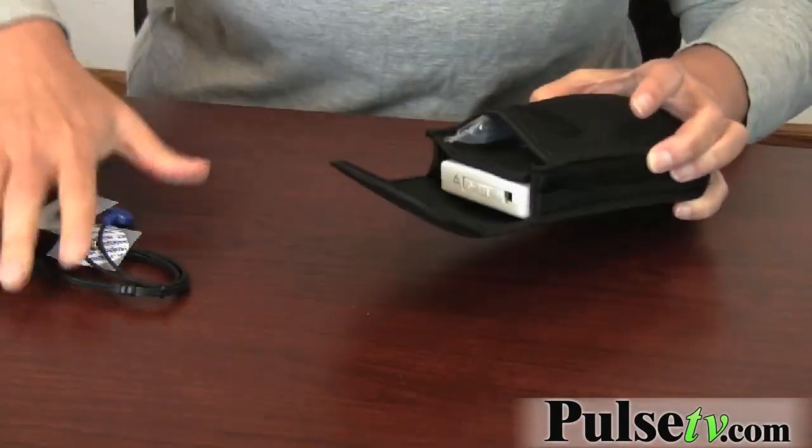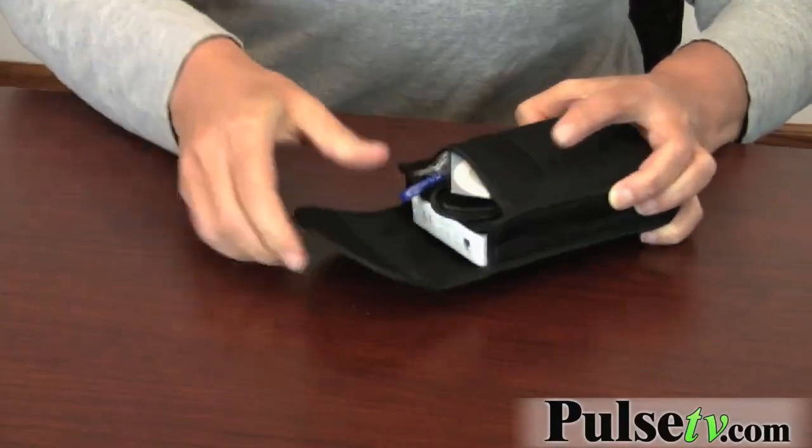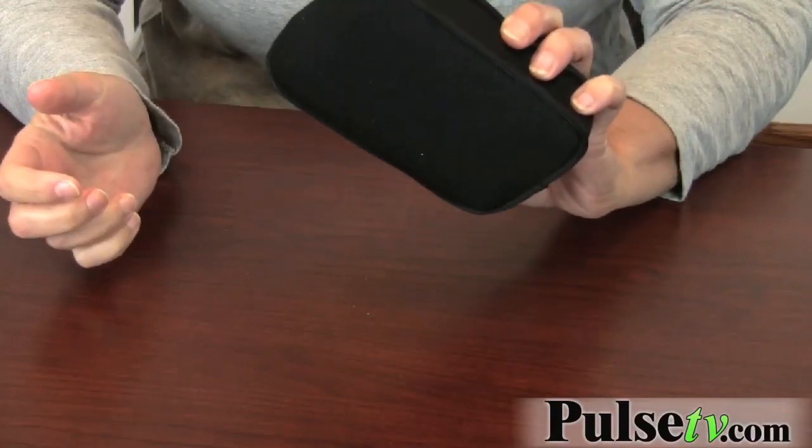It's perfect for traveling — you just put everything in it and throw it in your briefcase, backpack, or purse. Whatever you're doing, you'll always be monitored.